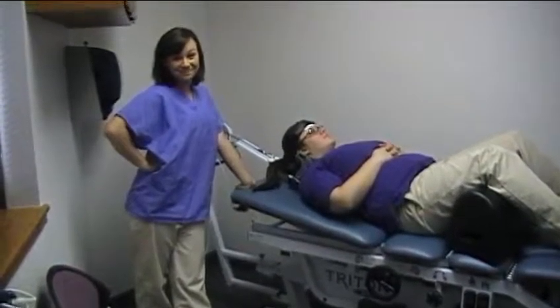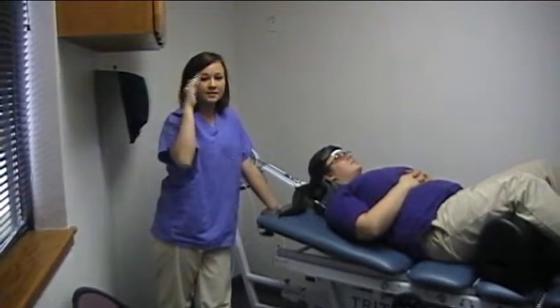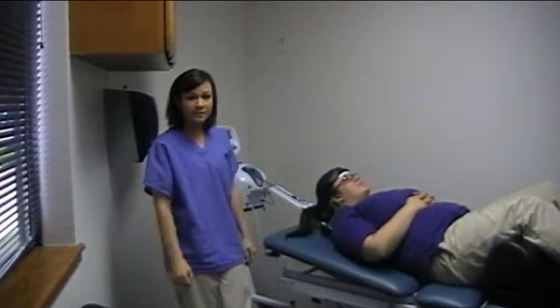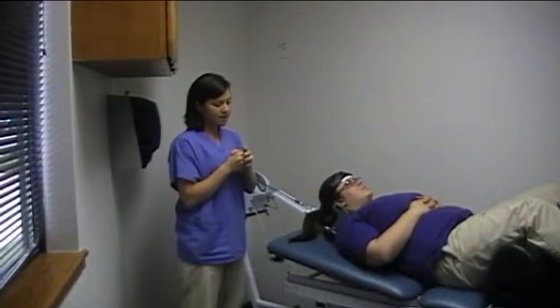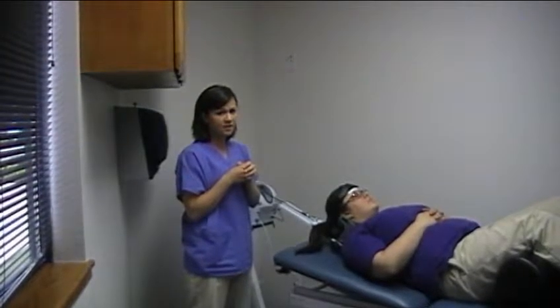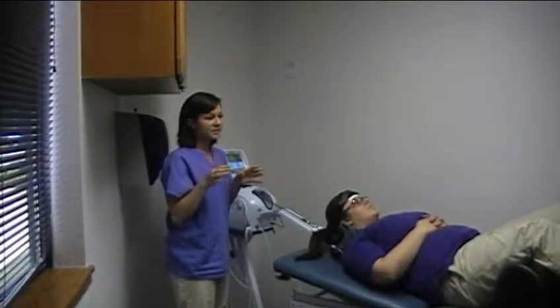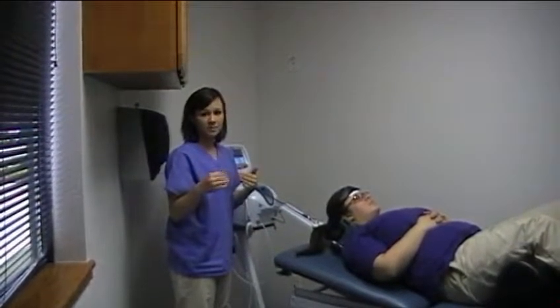Once you've found the right setting, let them be. It's really important that at the end of the cycle, when the screen shows zero for a while, you don't assume it's done — it still needs to finish its cycle. Let it go all the way through until the screen pops up and beeps saying the cycle's done, then click no when asked if you want to save. This ensures you don't take the patient off therapy too soon.